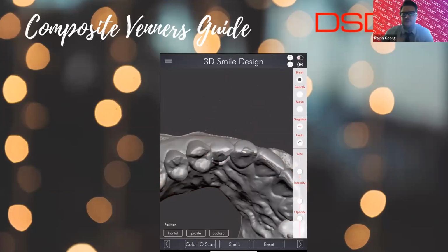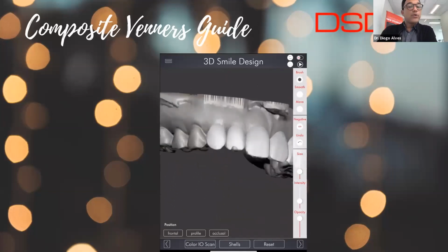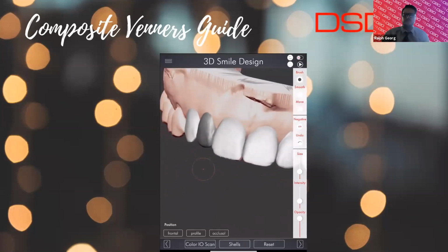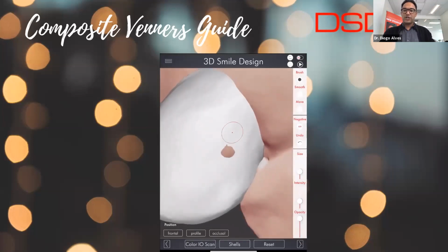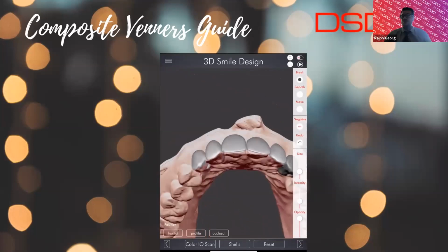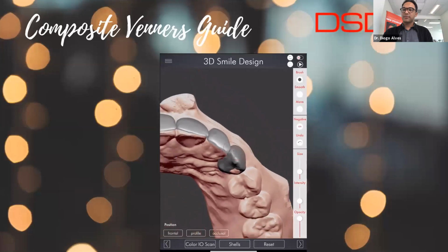What do you like to do? How does your workflow usually consist of? Doing this first? It all depends on the case. Like in this case, since it's a simpler case, I just do all the designs all at once, so I can have it all ready for my patient, and then just do it all in one visit. Which is a huge benefit for the patient, right? I'm sure they love hearing that.